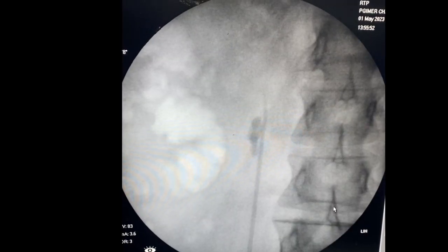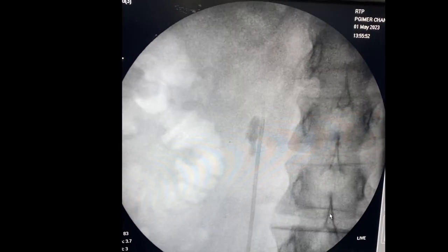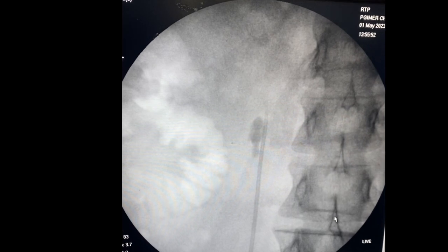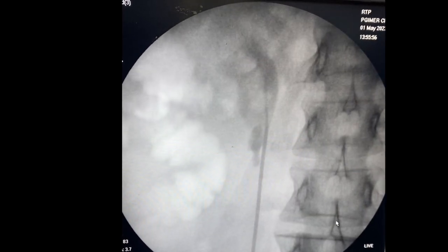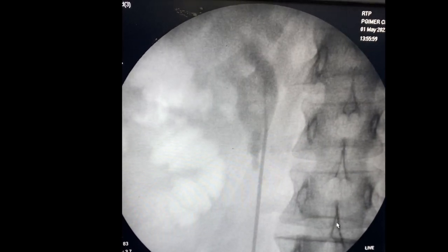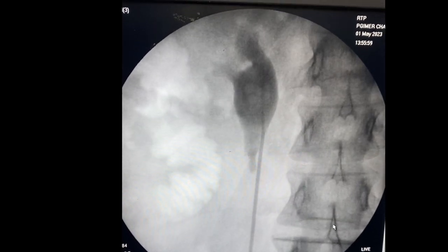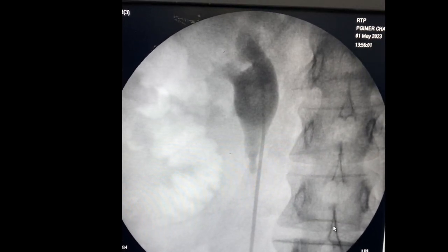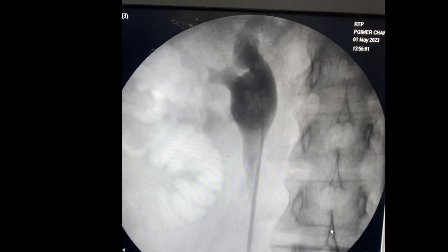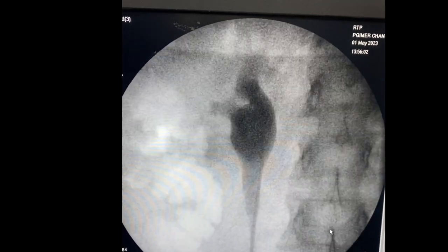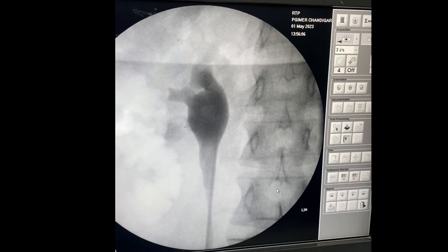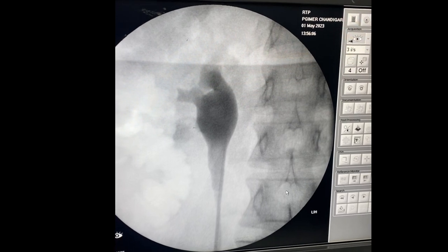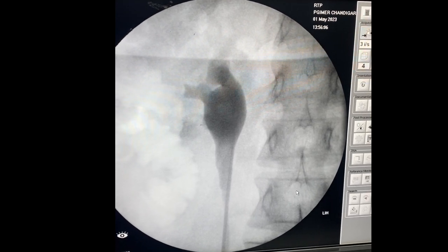The patient is now turned into prone position since we have planned prone PCNL. You can see the intraop retrograde pyelogram where the dilated pelvis and the upper ureter with the stone are visible.